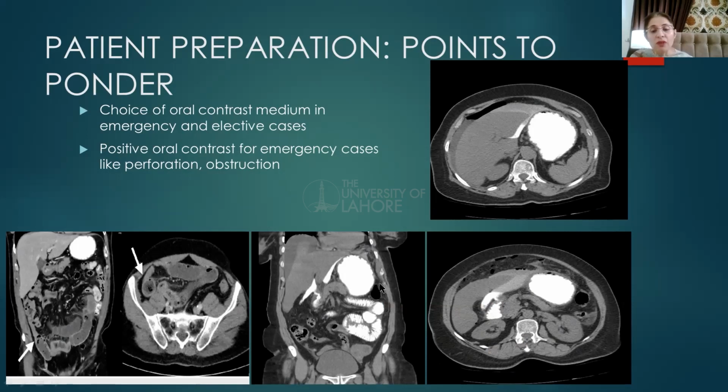So this shows the significance of the positive contrast medium in a suspected case of perforation, because the surgeon is already clinically suspecting a perforation and would like to know the site of perforation, which can be nicely highlighted here.